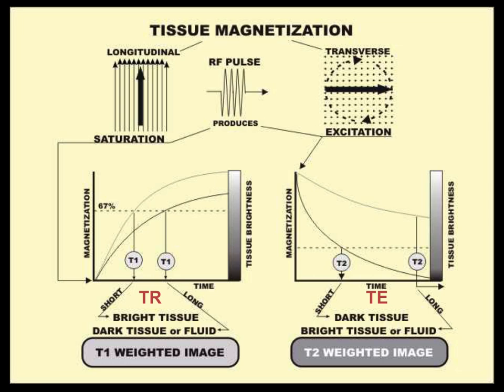So you can play with the level of the T1 and T2 intensity by changing the repetition time, or TR, which is the rate at which you're taking the images, and when you're taking the image in time. And notice that T2 contrast actually decays with time, so you have a limit on the amount of time that you have to acquire your image.